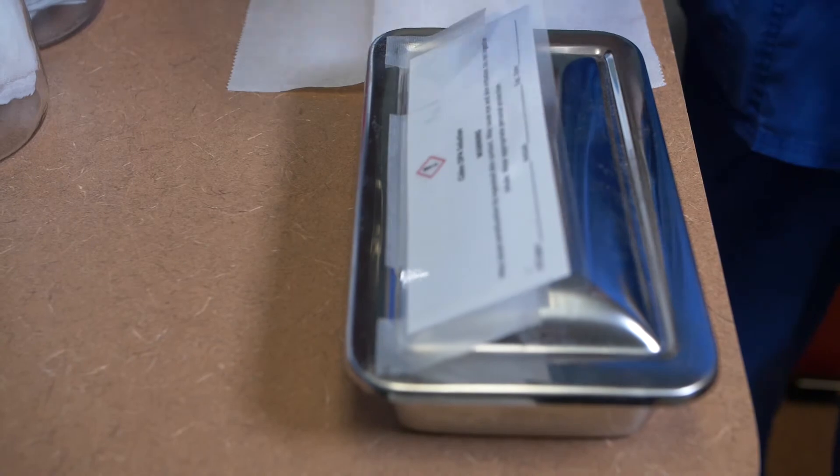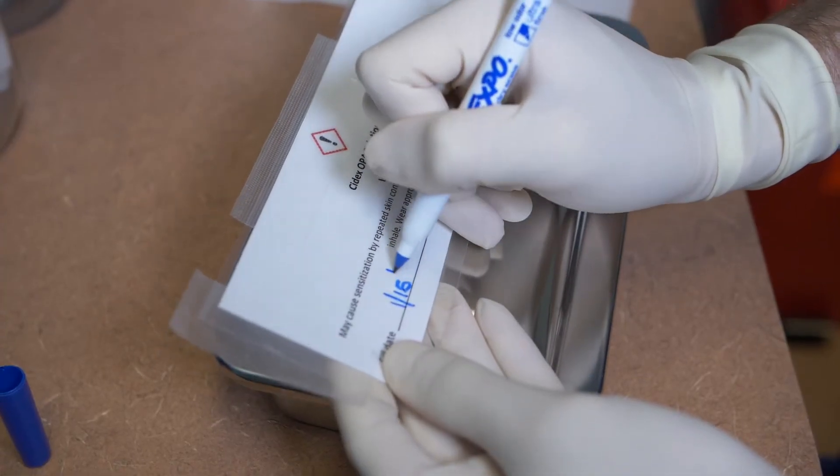Label with the name of the solution, the date and time required per the manufacturer, and initial.